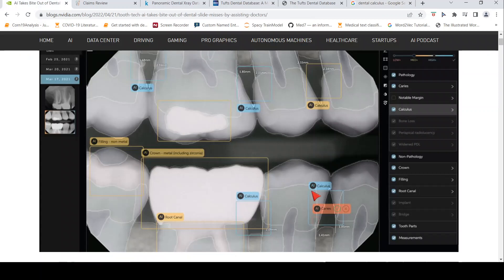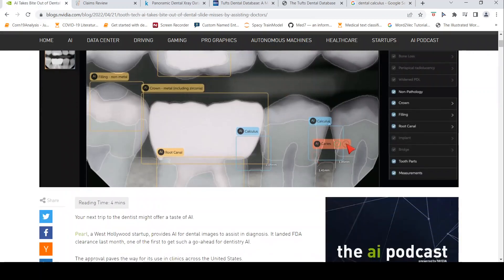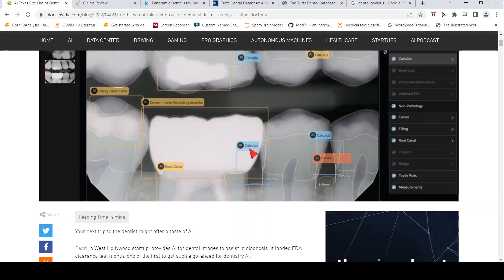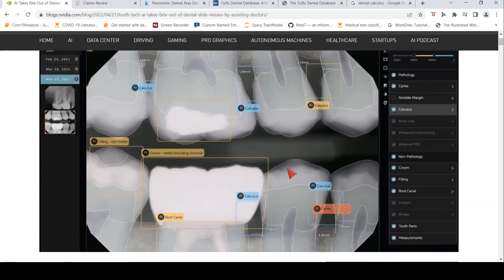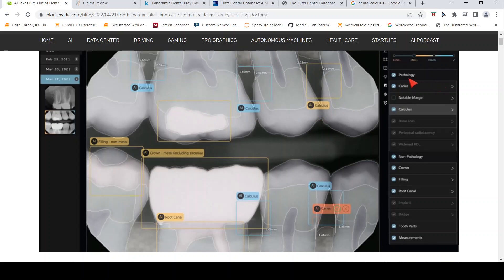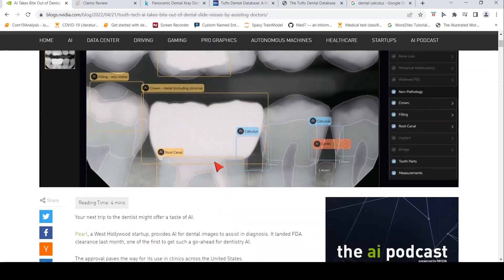This can cause tooth erosion or you can get cavities. Caries is nothing but dental cavities. Given this x-ray image, this particular algorithm is able to identify these abnormalities which are present over here. For example, in this tooth root canal was done and there is a crown.